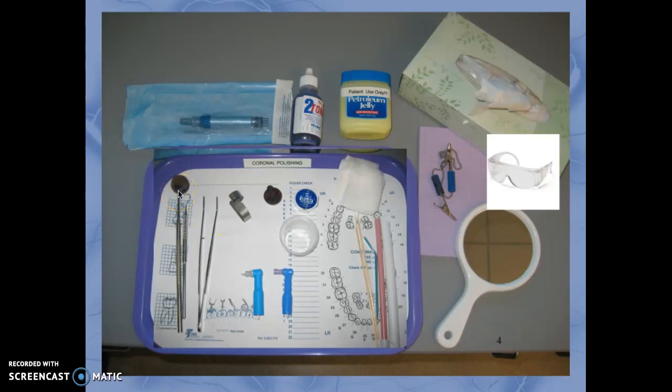The mouth mirror is used for retraction, reflecting light, and the ever popular indirect vision. The explorer should be used with great care by the auxiliary performing the polishing — in California it's the RDA — or not used at all. We don't want to be probing pits and fissures or fractures on teeth. We have to use great care, and of course the cotton forcep.